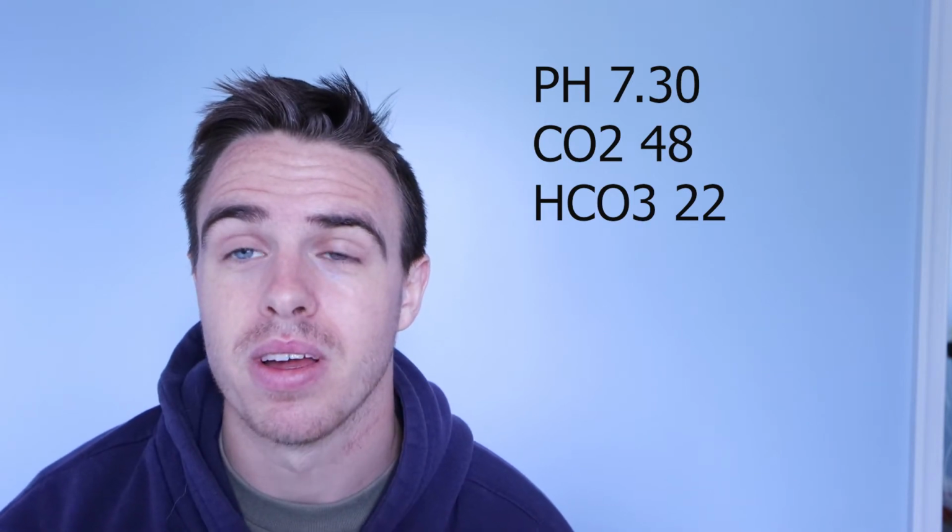Okay, we know our pH is out of whack, but what is causing it to be out of whack? Is it the CO2 or the bicarb? Which one is not normal? CO2 obviously is not normal. So what is happening? We have a bunch of CO2, which is more acidic, which is going to do what to the pH? Bring it down.